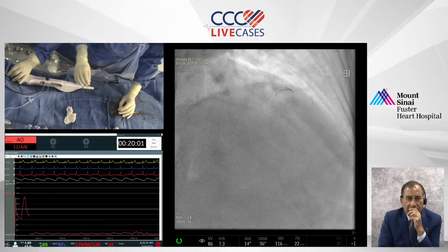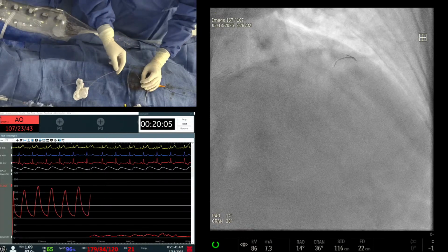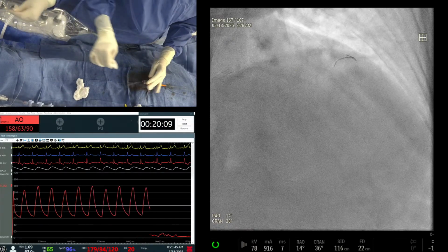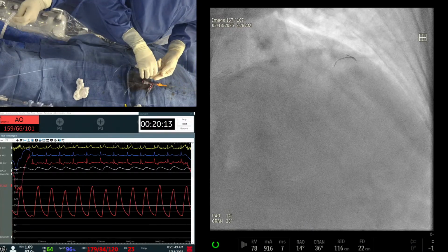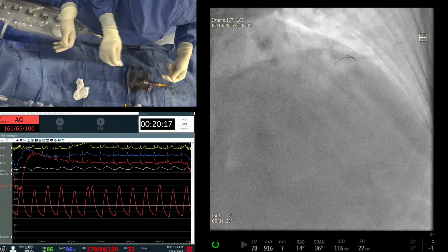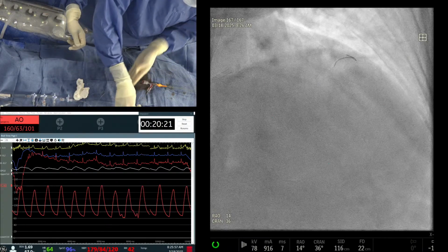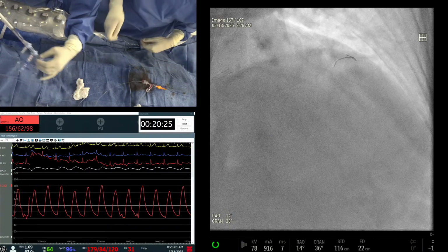Once you have a lot of resistance, there will be a drop. For two seconds, the empty yellow triangle came. If it becomes full, that means it's a very bad situation, and your drop in RPM is associated with slow flow, higher spasm, and that did not happen in this particular case. So therefore we said let's keep going.